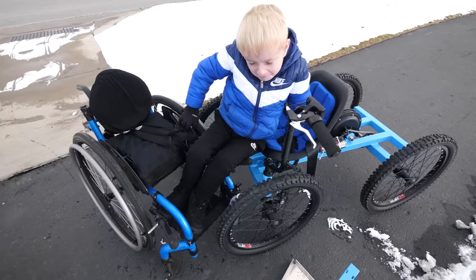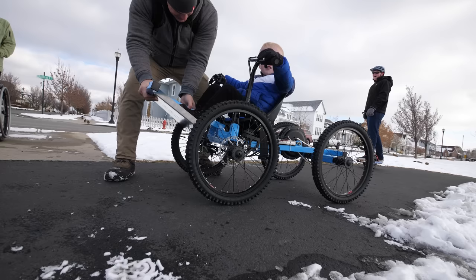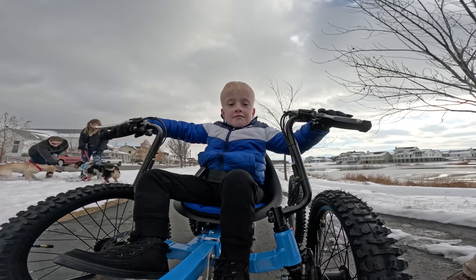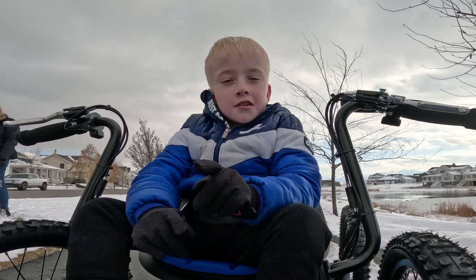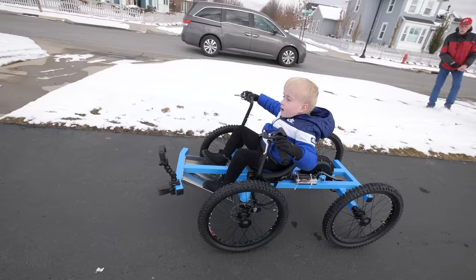Nice work! What's the horn? Yeah, we need a horn — that's like the first thing. This is the coolest thing ever. You're a YouTuber now, you've got a camera going on you. Hey, anybody that's watching this — first thing about this, these are the brakes. This thing can go 12 miles an hour. Just remember, I'm kind of a professional on this. Don't try this at home. Go a little more faster, because I want to bring some speed.